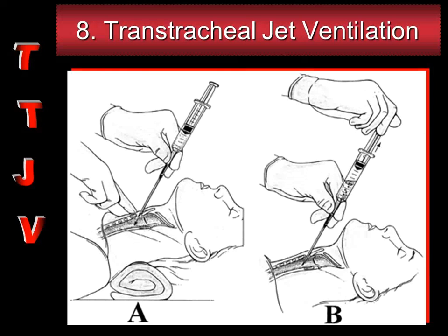All right, what do you do after that? Take the syringe off, attach the adapter. What size adapter works on it? Yeah, the one that fits. So if you take an ET tube, usually you're a size 3, size 4. I've even seen them up sometimes up to a 6. It doesn't always, but the smaller ones you can actually attach onto the tip of the Angiocath, and it'll fit. Then you can attach your BVM and all that stuff to it.